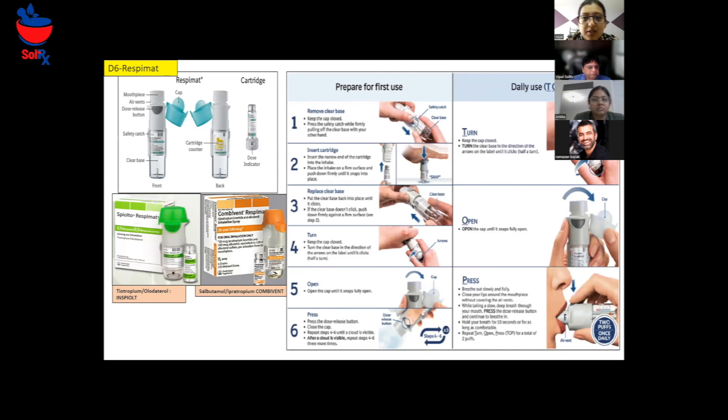First, we will remove the clear base and keep the cap closed. Then you can press the safety catch while firmly pulling off the clear base with your other hand. Then you insert the cartridge — the narrow end of the cartridge into the inhaler. For doing this appropriately, you place the inhaler on a firm surface and push it down firmly until it snaps into place. Then put the clear base back above the cartridge until you hear a click sound.